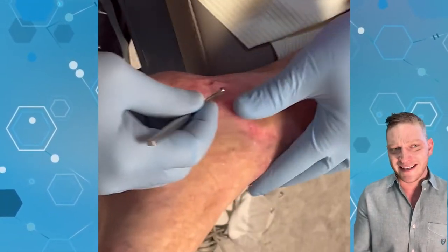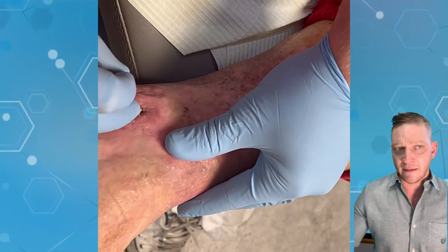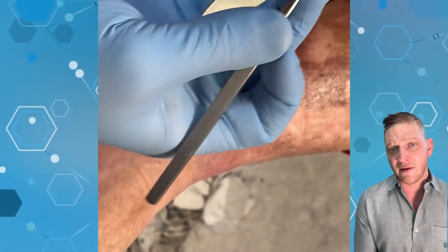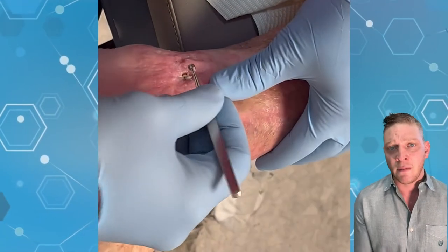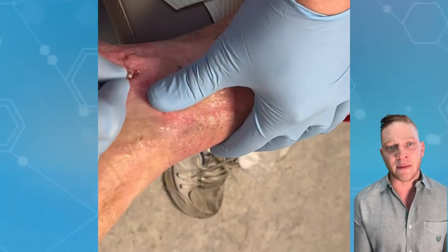You can see the cobblestone appearance that happens. He has to get vein procedures, he needs compression, he doesn't tolerate Unna boots. We gave him this special kind of — what I call — a lymphedema pump; it's a Flexi-Touch by Tactile Medical. I doubt he's compliant with it. We can have a more in-depth conversation about that maybe in future videos.